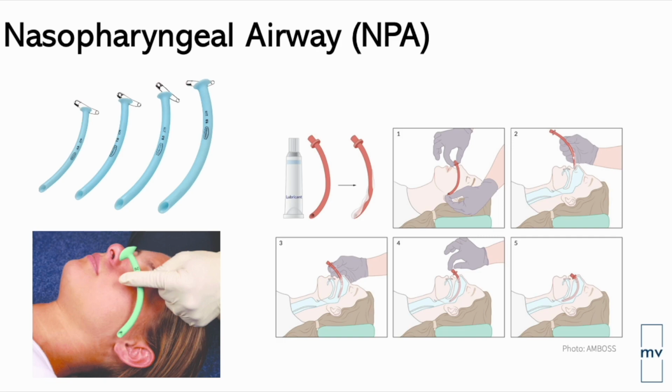The other thing to think about is these devices can cause epistaxis because you're shoving it in someone's nose. So if they are coagulopathic, if they're on an anticoagulant, or have a bleeding disorder, just be careful. Also be careful with nasal polyps and recent nasal surgery as well, for obvious reasons.